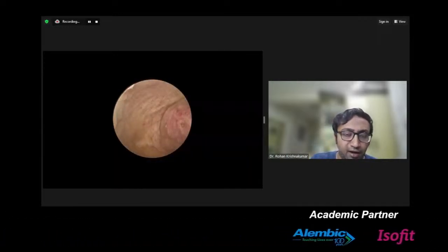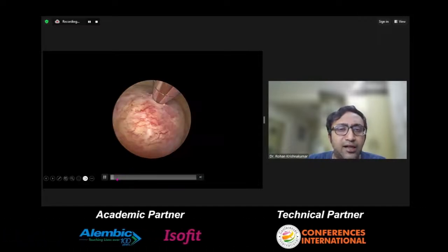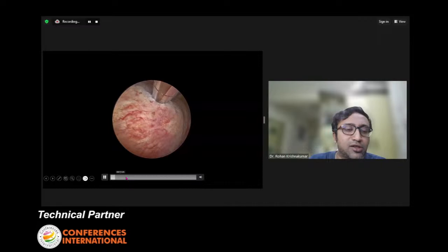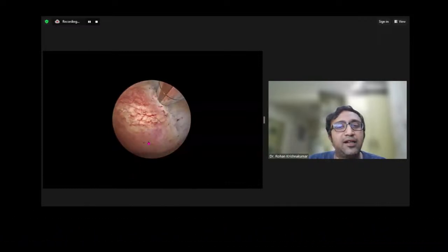Now this you won't believe. This is an infertile patient wanting to undergo IVF. She had a submucous fibroid, so we decided why not try with this. And this was done in the office, without anesthesia. You saw we entered directly with that.